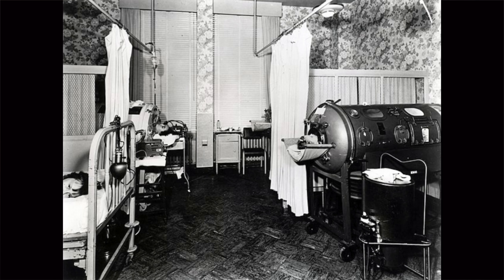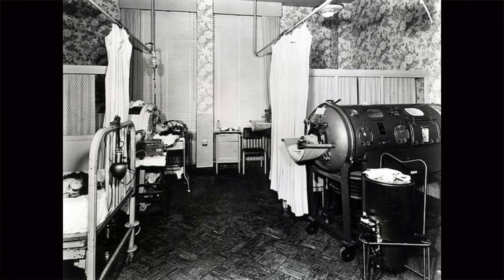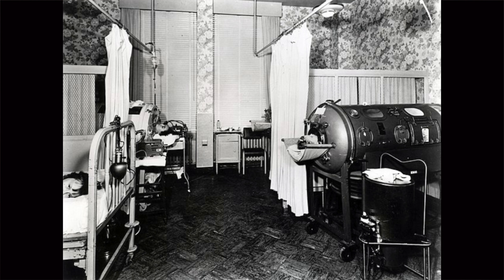These required continuous power, a lot of electricity, and the patient had to stay in the machine sometimes for weeks or months. The first time the iron lung was used on a patient was in 1928, and it gained its notoriety in the 1940s and 1950s during the polio epidemics.